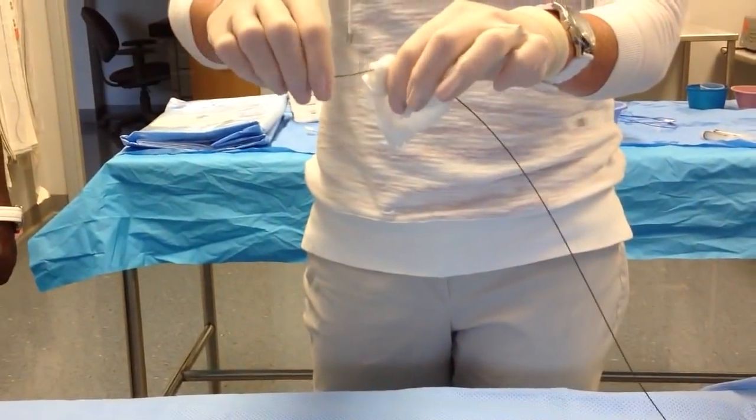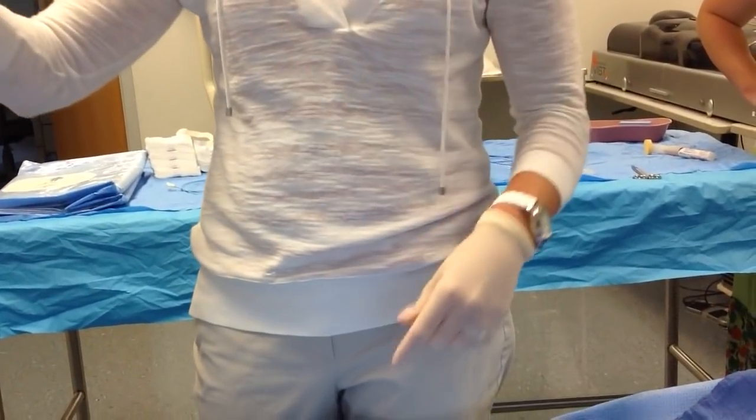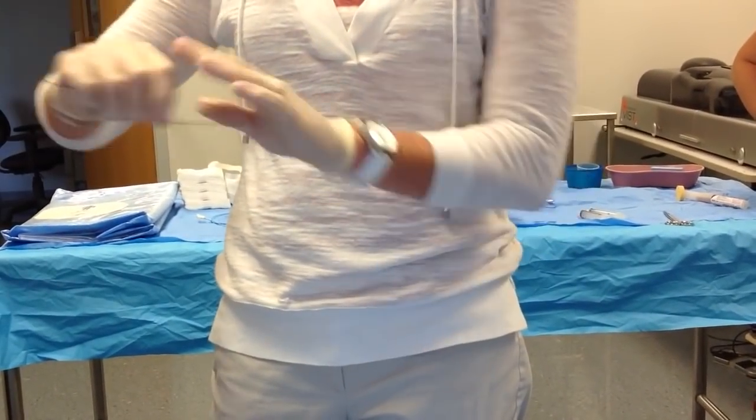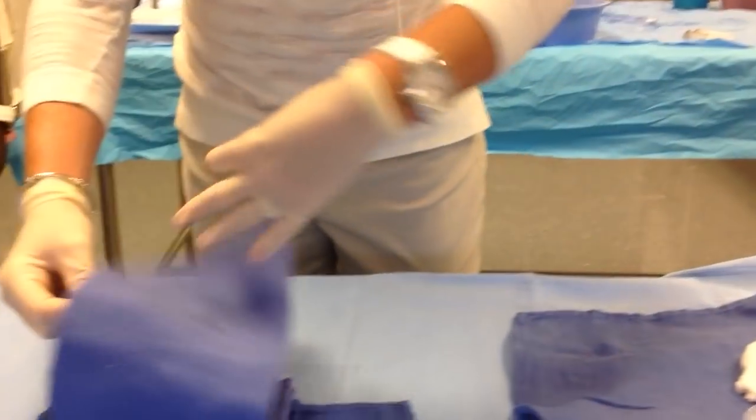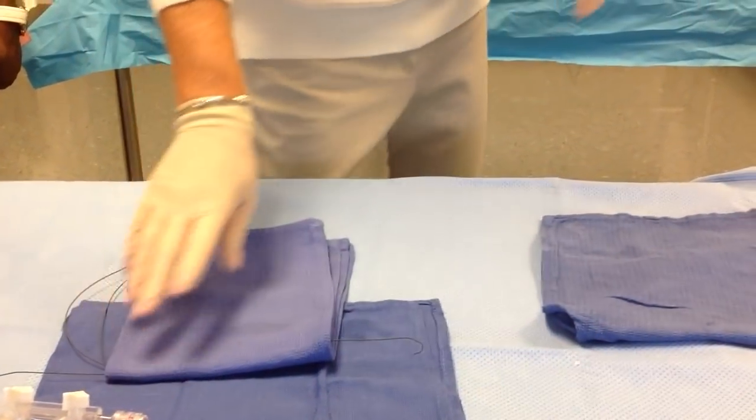So you're going to take your wet gauze here and just make two loops. Why do you do that? Why do you wipe it off? Because it has blood all over it. Okay. And that's the same guide wire you're going to use throughout? Yeah. You use the same one.